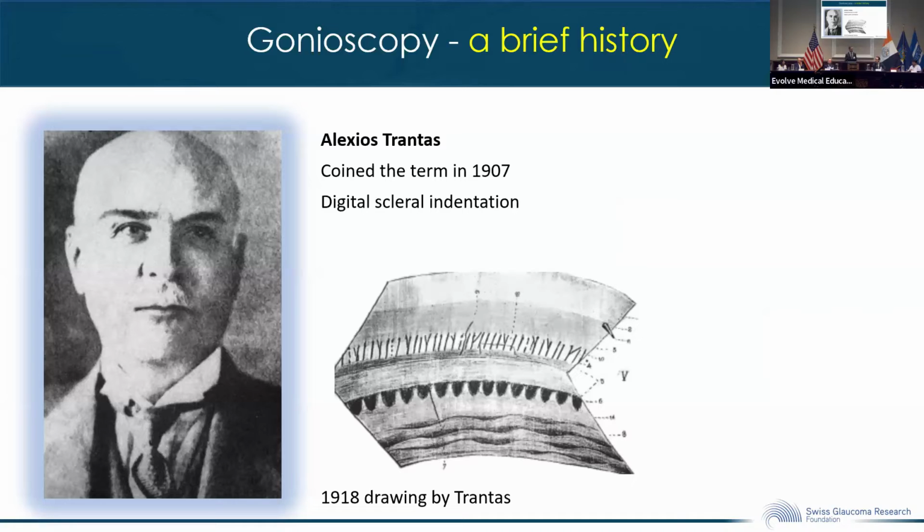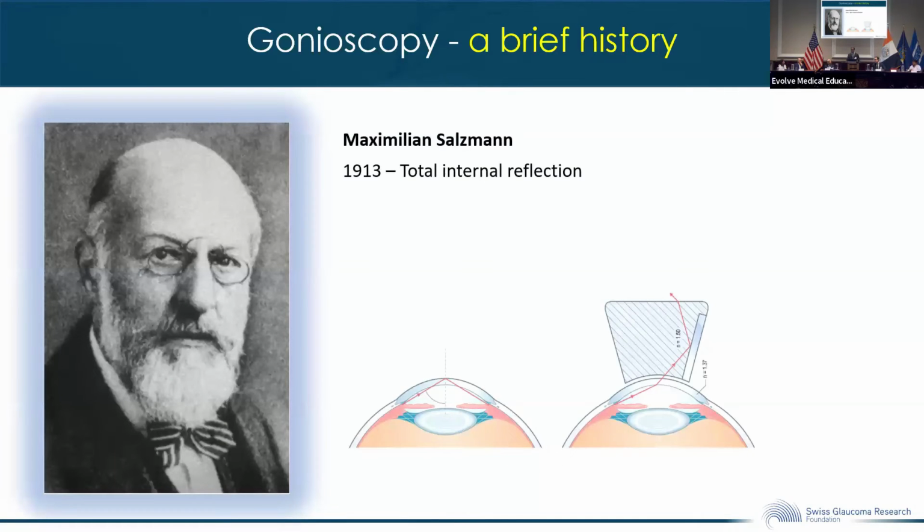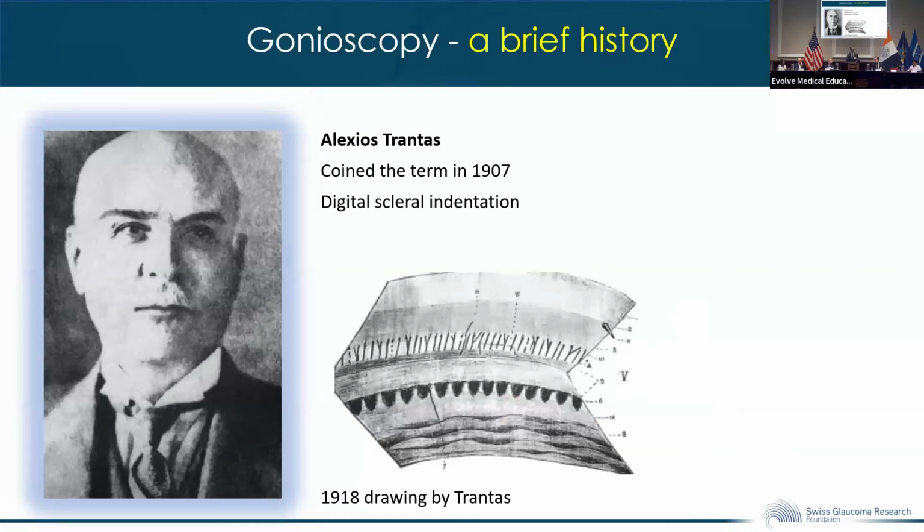He used digital scleral indentation and the direct ophthalmoscope to observe the angle. Of course, doing so probably distorted the angle structures significantly, but it was a first. It was a first way to visualize the angle, and he subsequently managed to produce very detailed drawings of the angle and advanced the understanding of the structure.